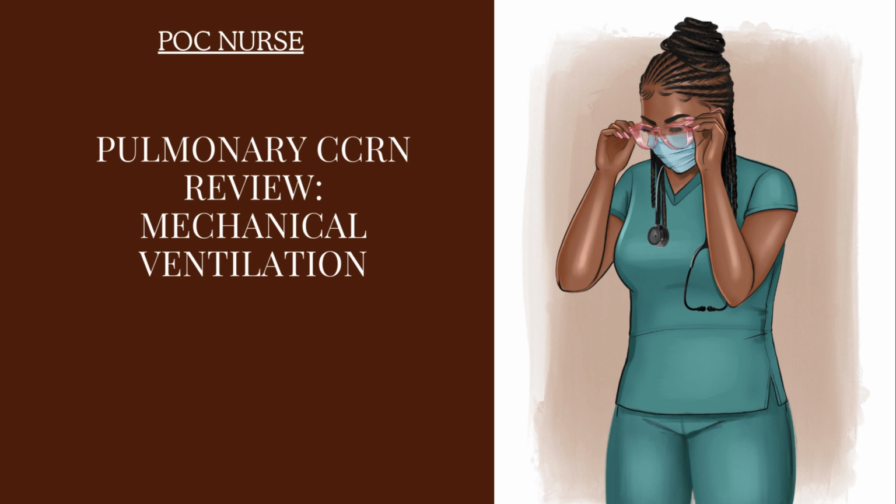Does the patient have a lot of secretions in the ET tube, and the tubing that goes from the ventilator to the ET tube? Is there water in it? Anything in the airways, such as mucus, that decreases the diameter of the airways itself, the ET tube, or the tubing that goes from the ventilator to the ET tube, could cause a high pressure alarm to go off. If the patient has a lot of secretions, it could obstruct the ventilator from delivering oxygen to the patient.